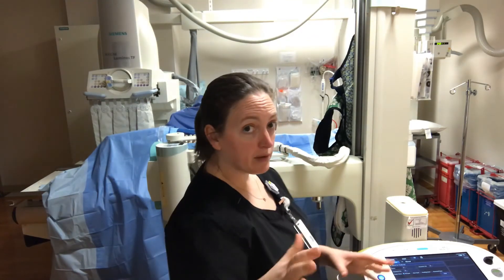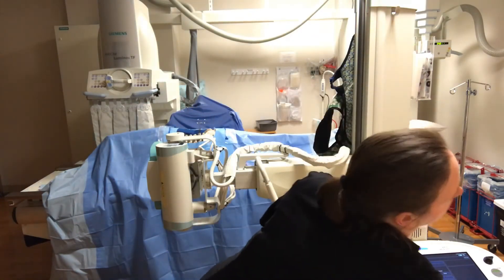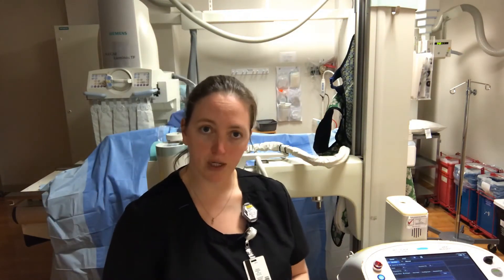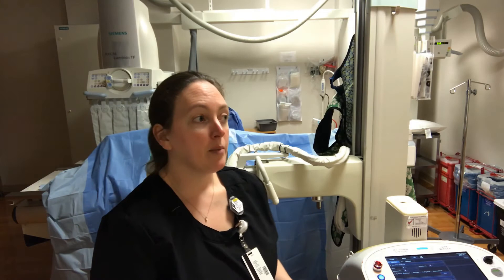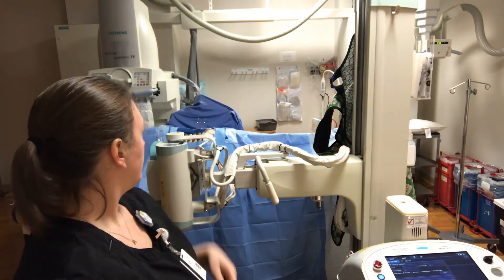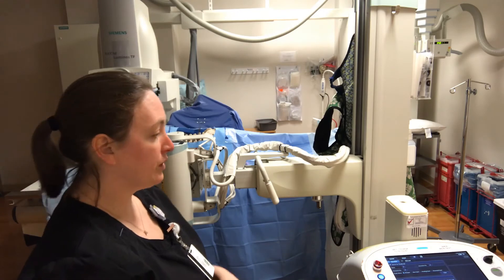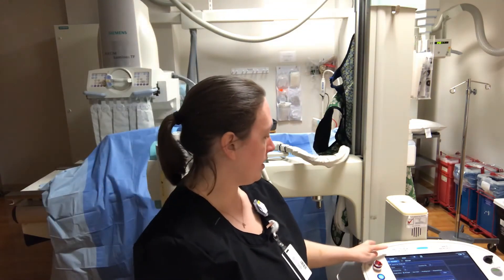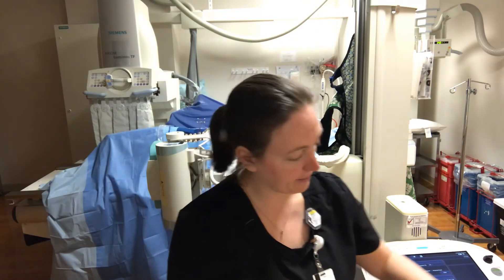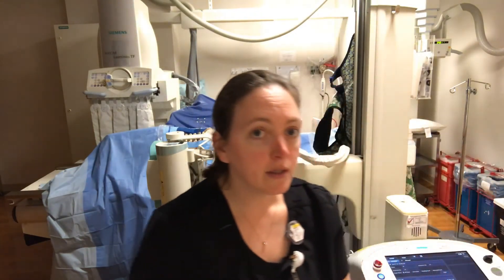When I'm all set, I'm gonna ask anesthesia to please hold respirations. This will help reduce any motion on the image. Then I say 'ready for x-ray' and wait for everybody to move at least six feet away. At that point I can rotor, expose, and shoot through, and it will come up on your screen. You're simply going to make sure you can see the metal marker and mark it with a cross-table.